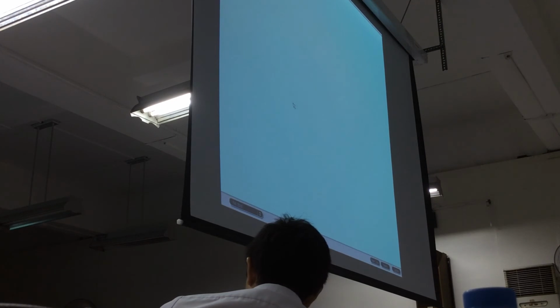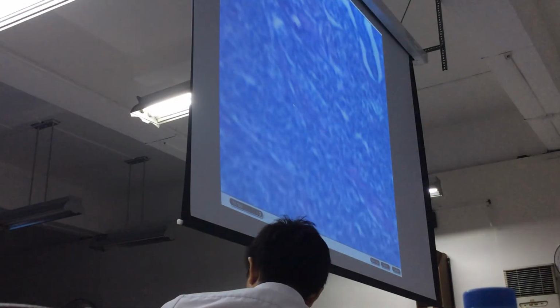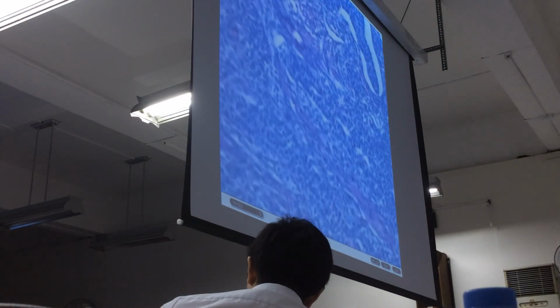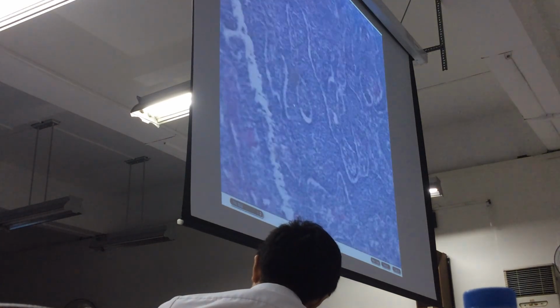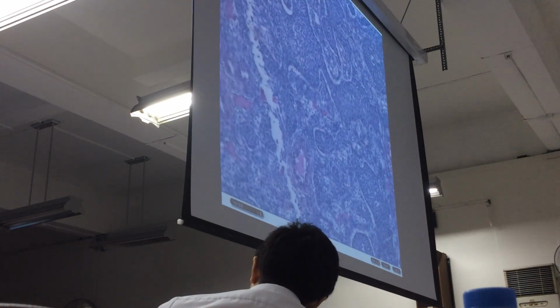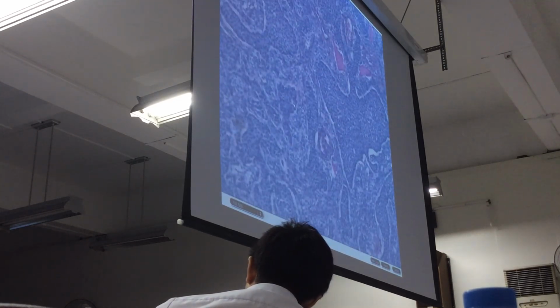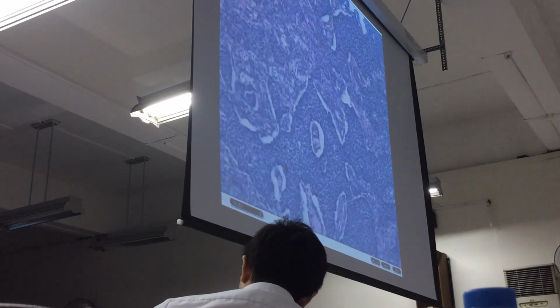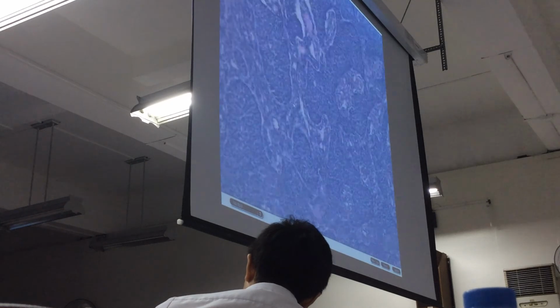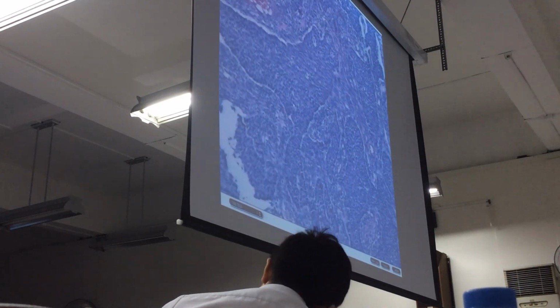Another ovarian tumor. Lower magnification will show you columns of cells of this particular portion, and you will recall them as the ones lining your ovarian follicles. Okay? These are actually granulosa cells which has formed itself into tumors.